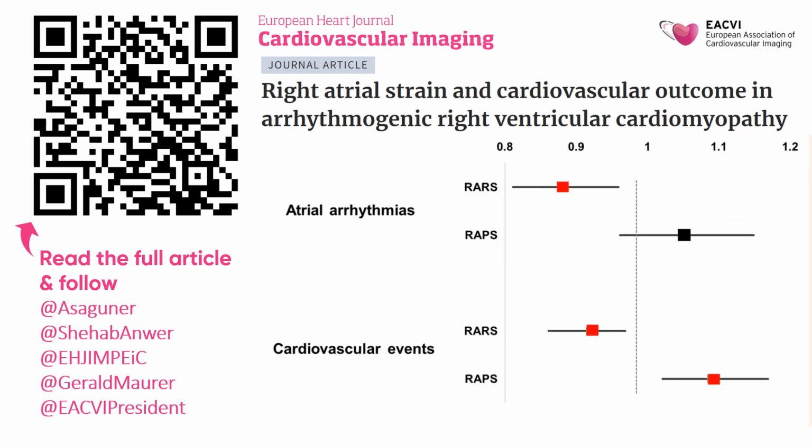The reservoir strain was associated with an increased risk of atrial arrhythmia as well as cardiovascular events, and the right atrial pump strain predicted cardiovascular events as well.